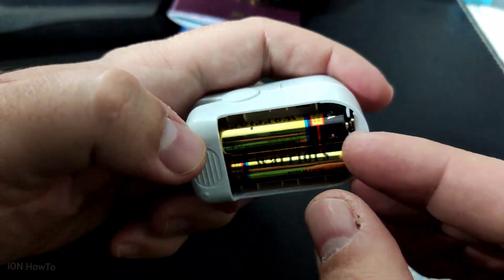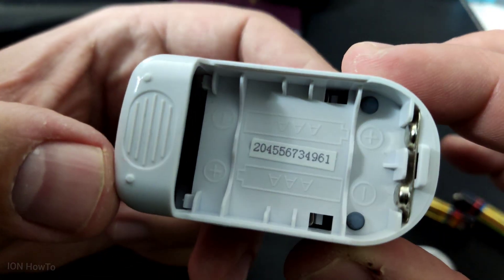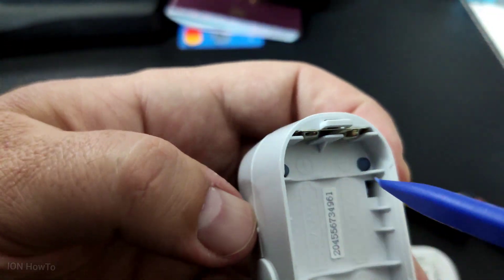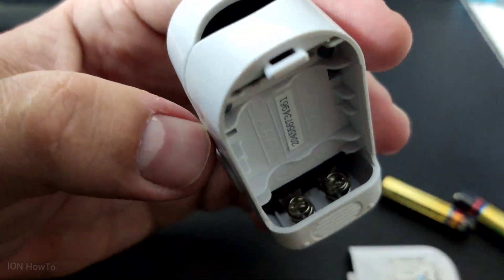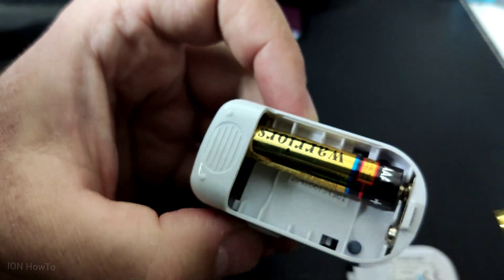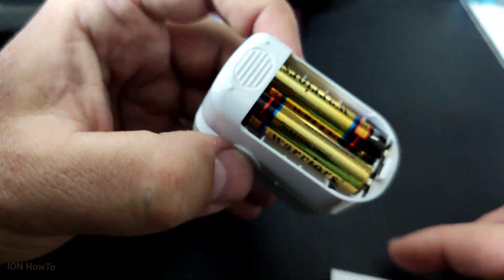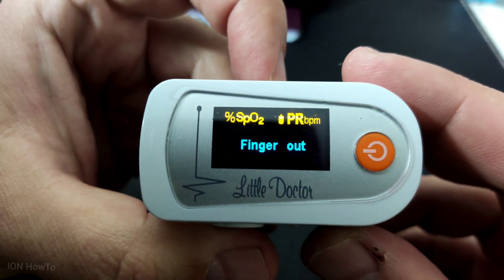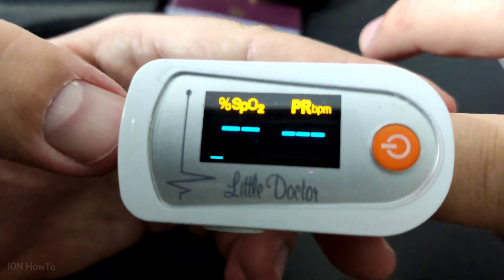There are many brands that make it, and this one uses two AAA batteries, which is actually pretty good. You should look for one that uses AAA batteries and not a button cell battery, because these are easier to replace and you can even use rechargeable batteries.